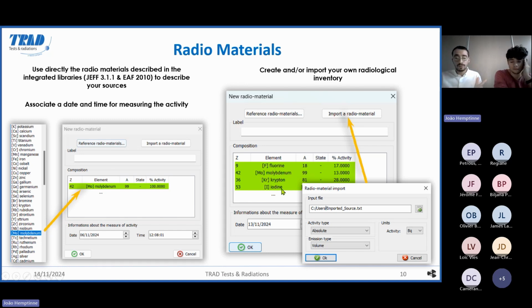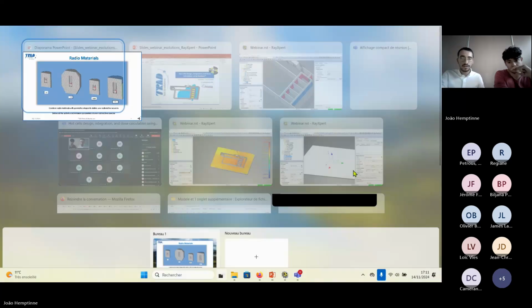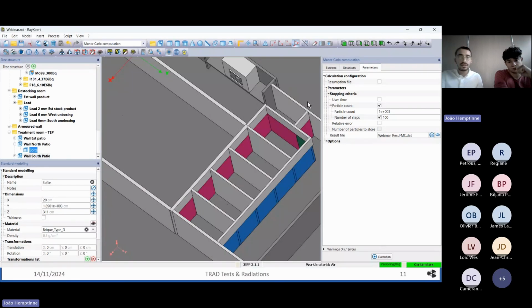Then when you have created your materials, you want to assign them to specific shapes in the model to create sources. Here, as Leo said, he created spheres to represent the radioactive sources, and he assigned the materials I showed just before to each of these. So you can see here you have a source of 18 fluor, etc. If we go back to the model, Leo can present how he did the sources.